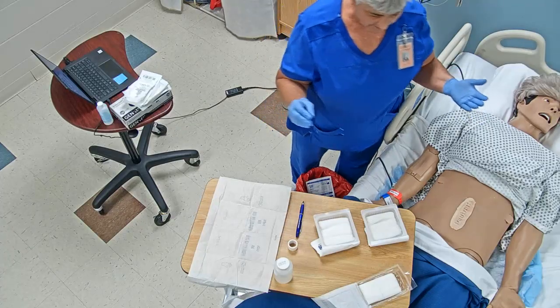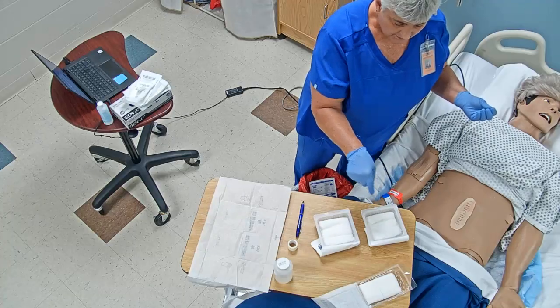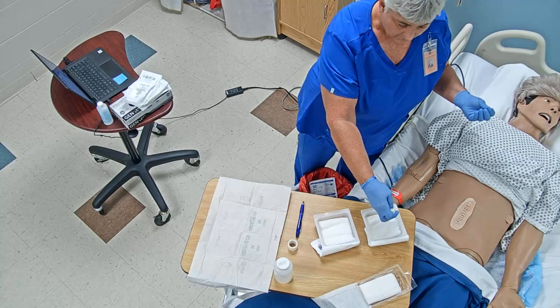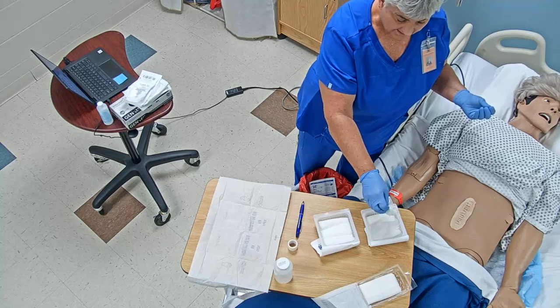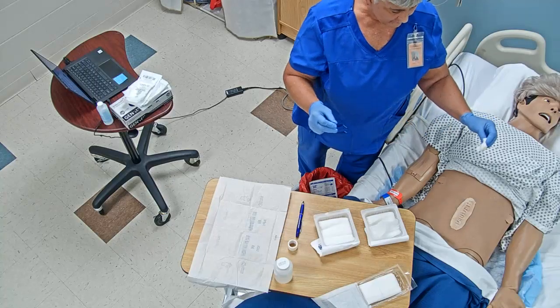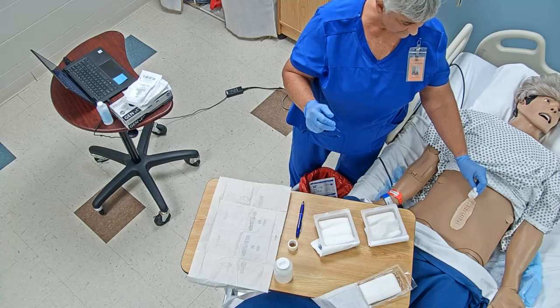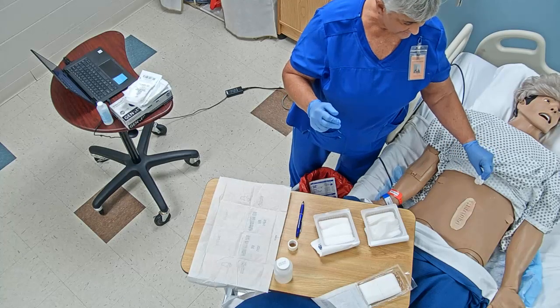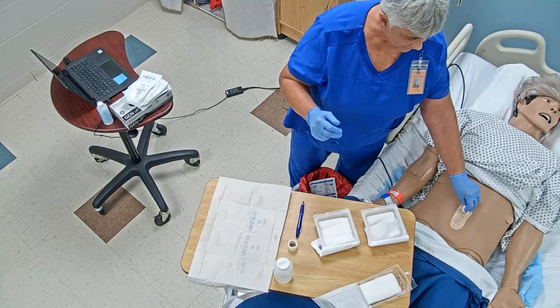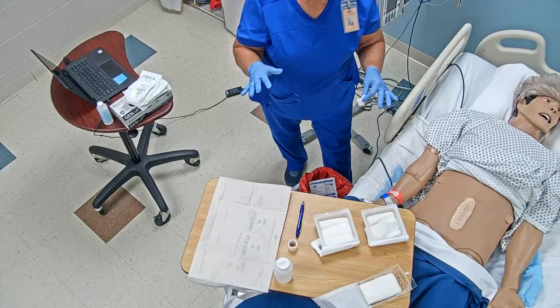So now I'm going to go ahead. This is my cleaning. I need to make sure that I don't touch the outside as I go in, so I'm going to get one, making sure that the other ones don't touch. I'm going to squeeze any excess out. I'm going to transfer without touching, and with this one we're going to go down the center. So the first one is going to go down the wound, okay? So we don't start way out here, because then we're dragging bacteria. So I'm going to start at the point of the incision and work my way down, okay? Step back with my hand still above my waist.